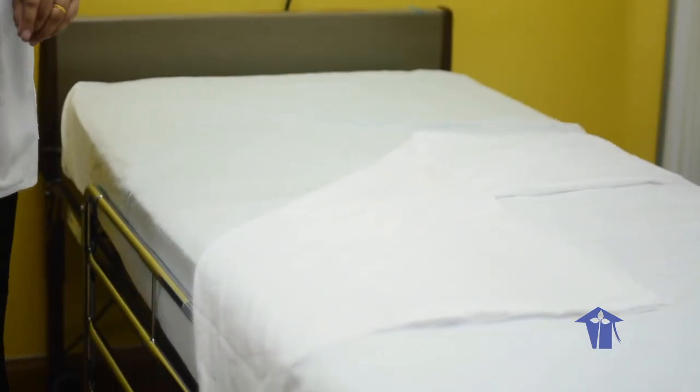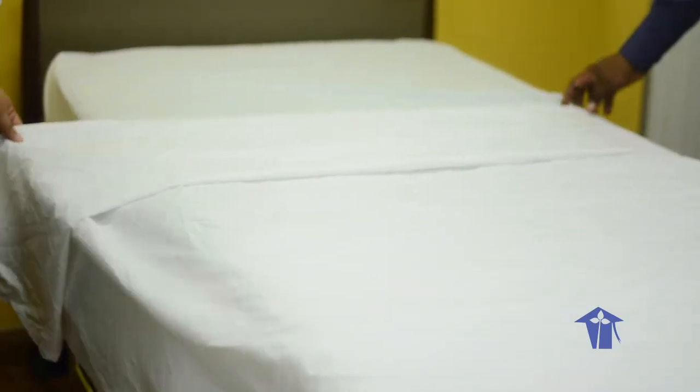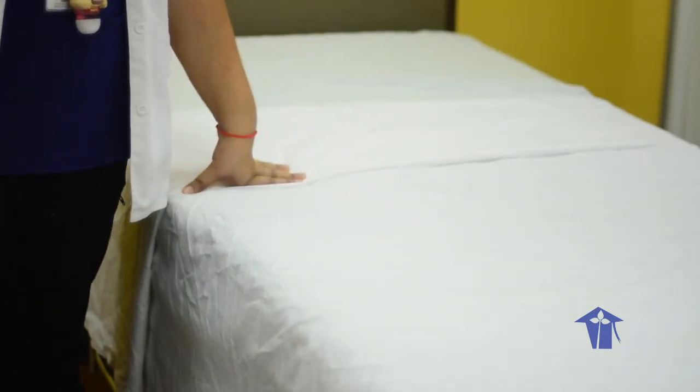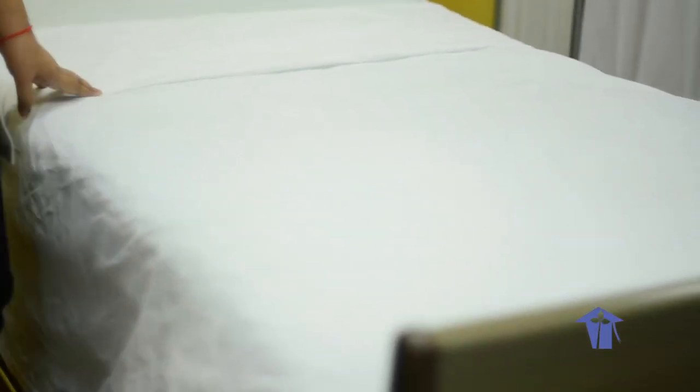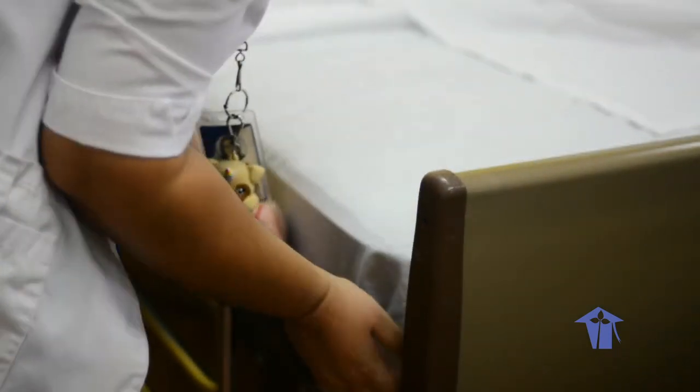Then we are going to move on to a theatre bed. Again, different wards have different protocols, which means different ways of making their bed. So obviously if you are on the ward, you will go according to what the ward does, right? But I'm going to show you how to make a theatre bed. With the theatre bed, you will have your bottom sheet as before. All right, no mitre. Good. Now your top sheet, going to flip it over.